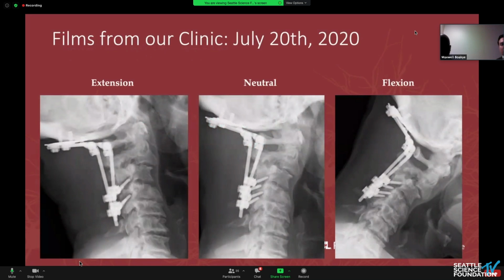This is obviously a very major reconstructive problem with posterior hardware that's pushing the C-spine into malangulation. So revising this is unfortunately necessary, and it's probably taking the posterior hardware out, realigning the neck from the front, as Rod said, and then probably putting a posterior fixation in. I'm actually curious and would love to hear your thoughts. Might you think about not fusing to the occiput this time, just stopping at C1?